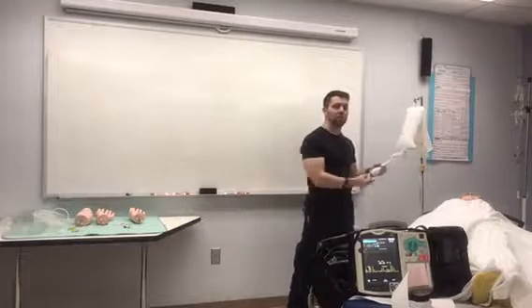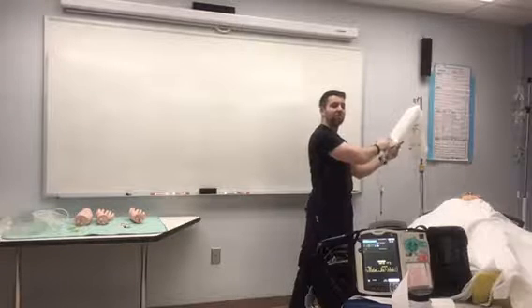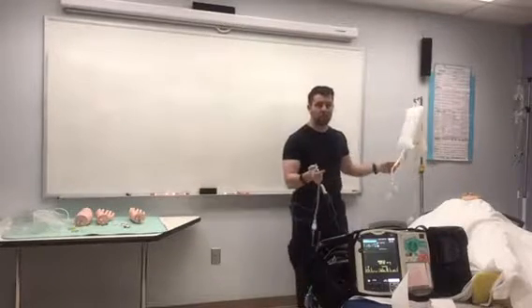We'll go up in elevation. This is full of air. As we go up in elevation, Boyle's law says this expands. As it expands, it puts more pressure on the bag. And now, this goes hyperpressure, and now we're in the red.